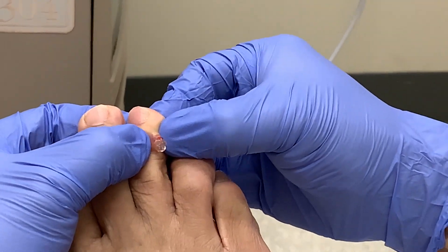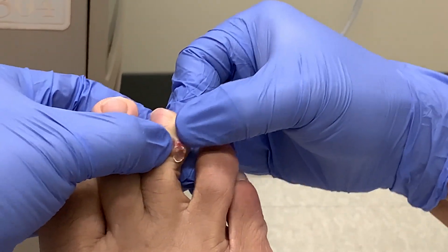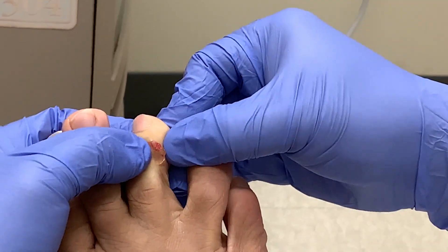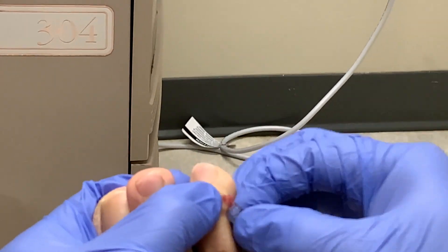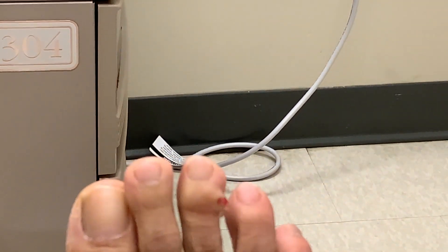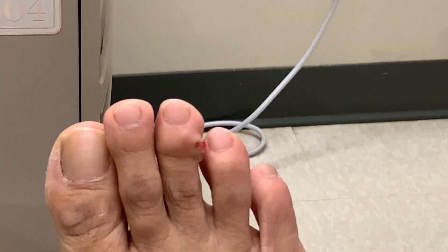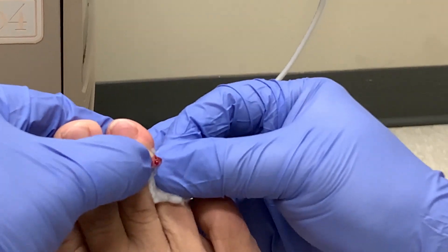Check out that clear white jelly — very cool. I thought it would be more like pus, but I was wrong. It's more like a silicone gel.